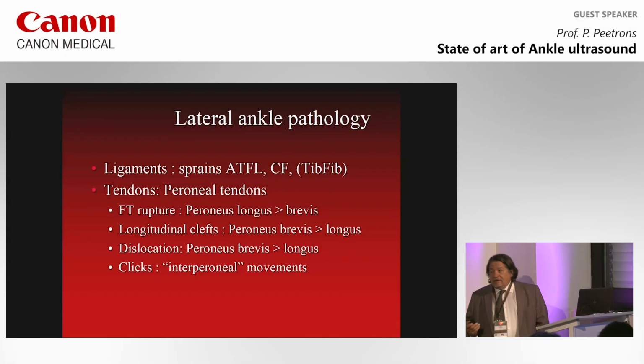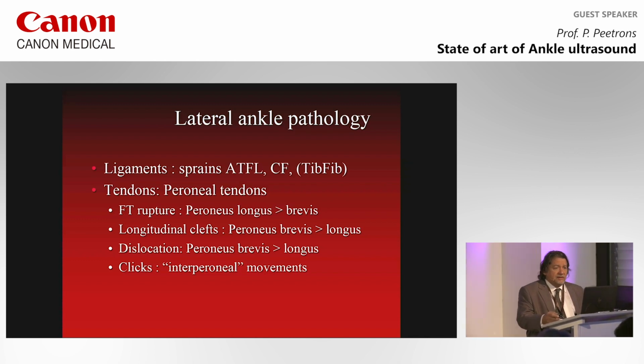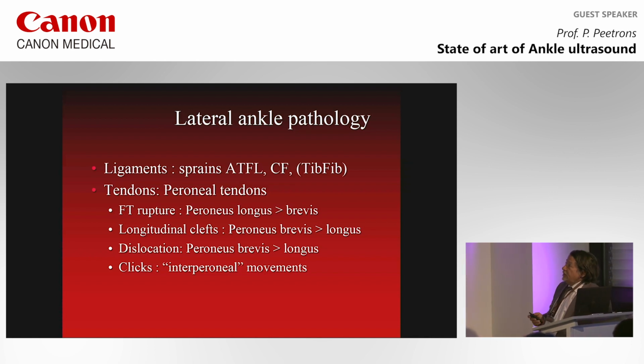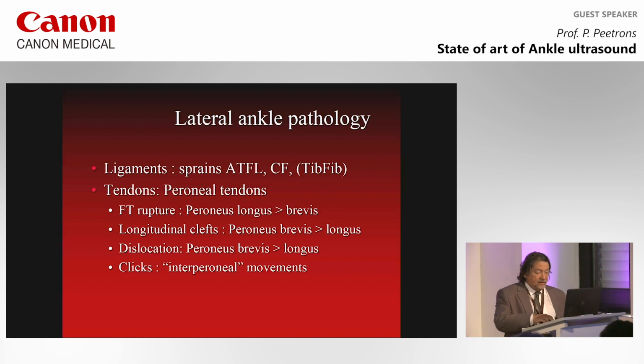I have an I-800 and I-600 also, and I have worked with this for maybe 1.5 years. So what I will do is give you some new tips, maybe some you know, some you don't know, about ankle sonography and about the ligaments and tendons in the ankle, and also one nerve that we will see. So we'll speak about ligaments, sprains, tendons, and the tendon rupture, peroneal tendons, the rupture, the cleft dislocation, and the clicks. I will show you some videos about that.